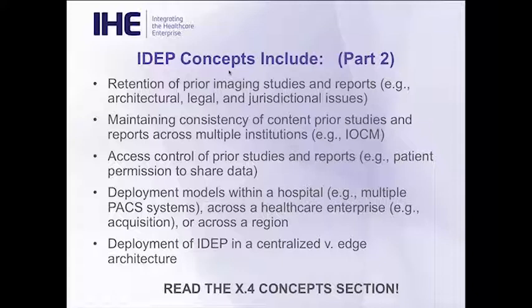The point of this, however, is that in every IHE profile, there's a section 4, which is called the concept section. In this particular profile, that section is going to be very important. It's going to be longer than most, but it's going to be very important just because there's a lot of different variations and ways that we could deploy IDEP at different institutions.